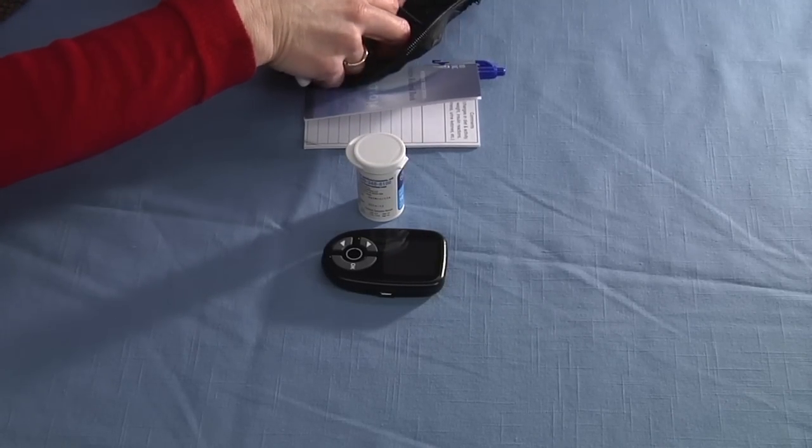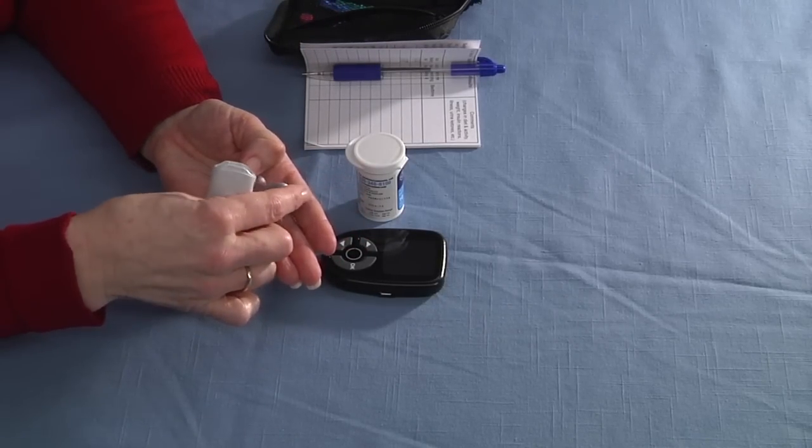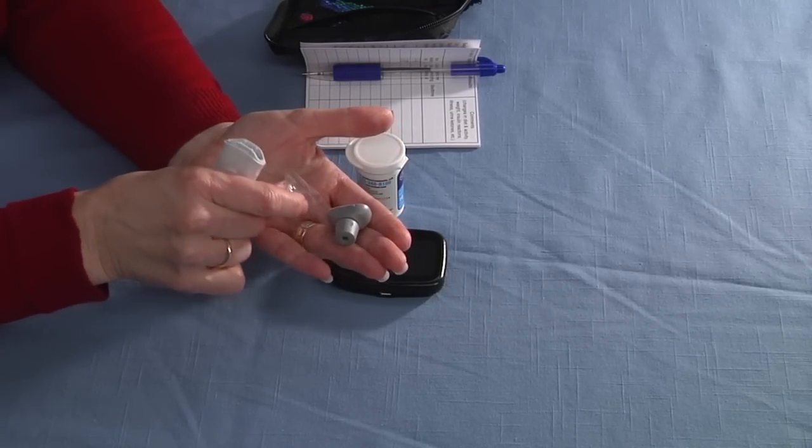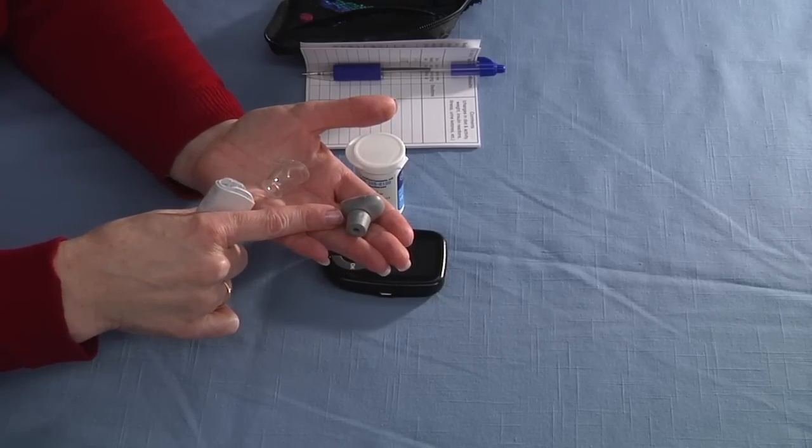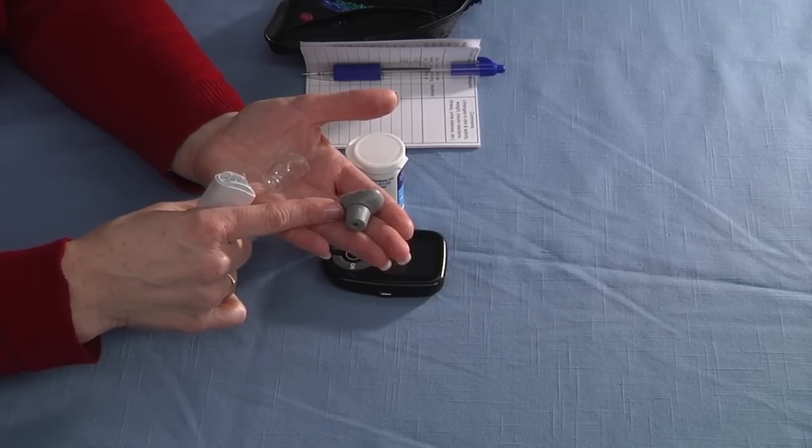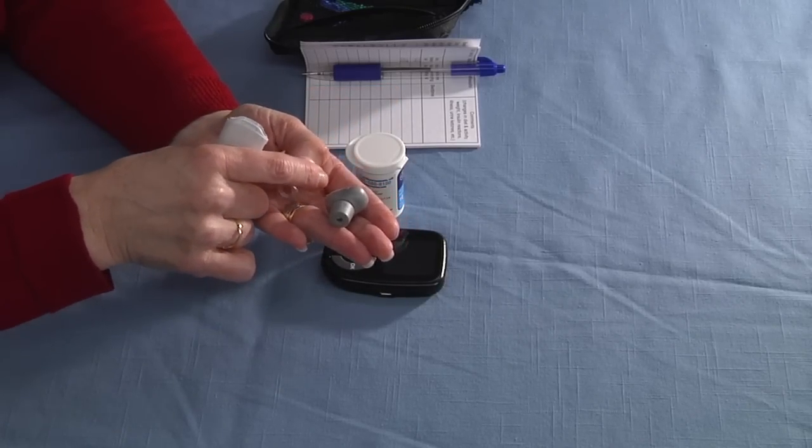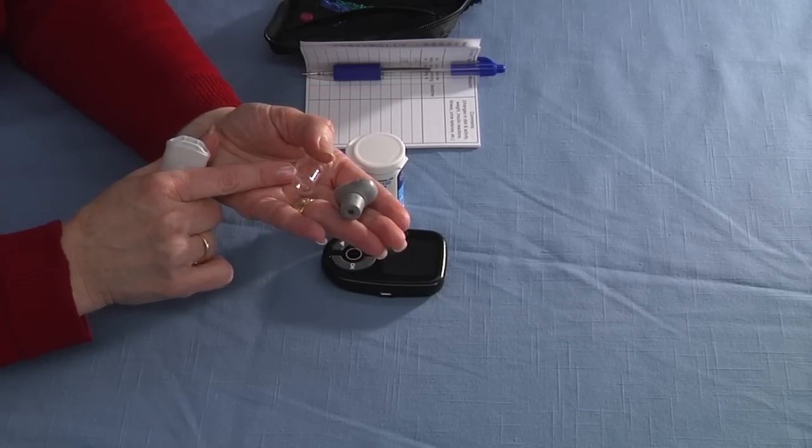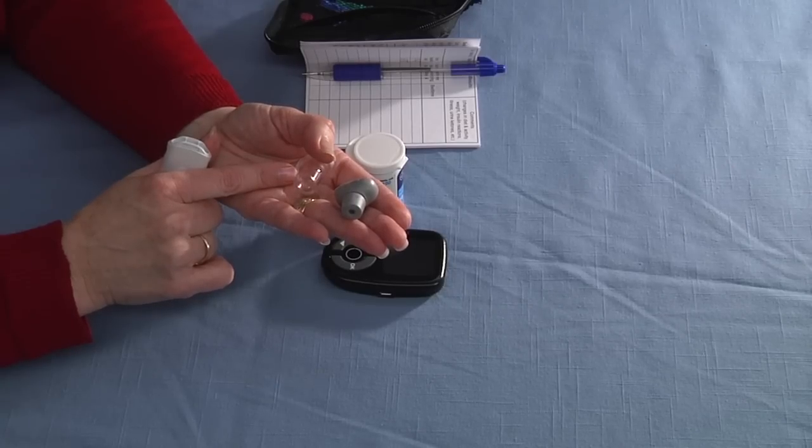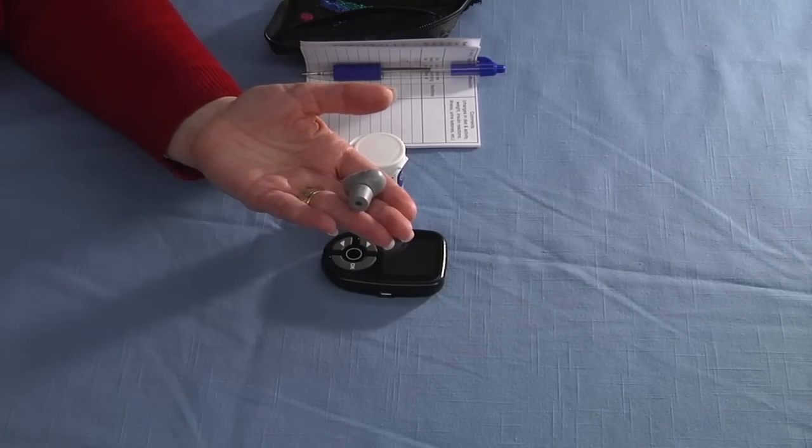Next you'll want to get out your lancet holder. This particular lancet holder comes with two different colored caps. The solid colored cap that I will be showing today is to be used on the sides of your fingers. The clear cap is to be used on sites when you're not using the sides of your fingers. Today I'm going to use the side of my fingers, so I'm going to take this one away.